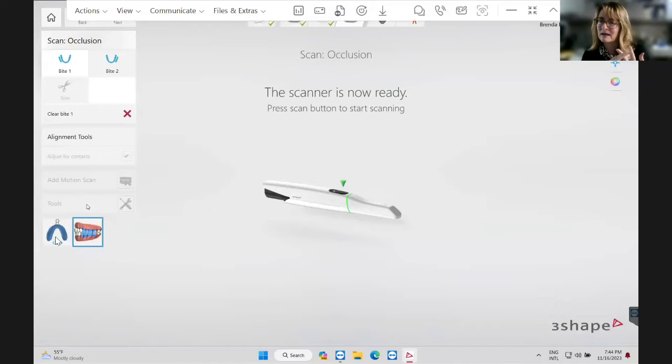So I might cut a finger off my glove and put it over to help, because you need something sort of sturdy to hold the lips and cheeks back, but you need to be very gingerly in doing so. You don't want to overextend.